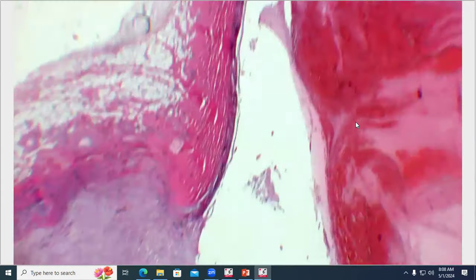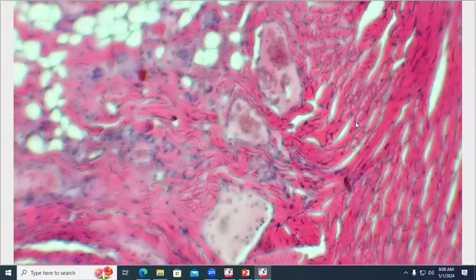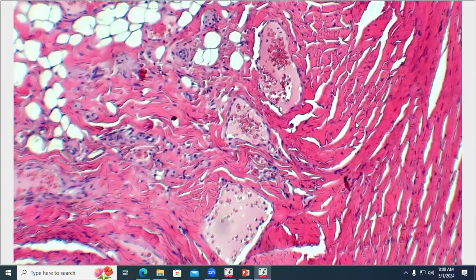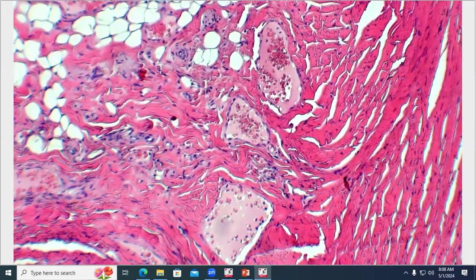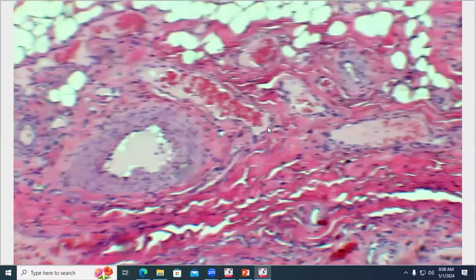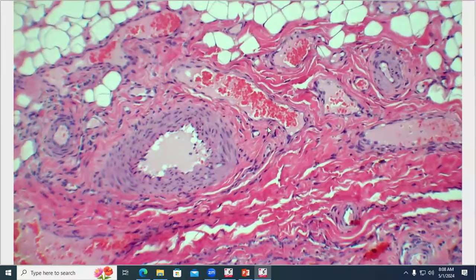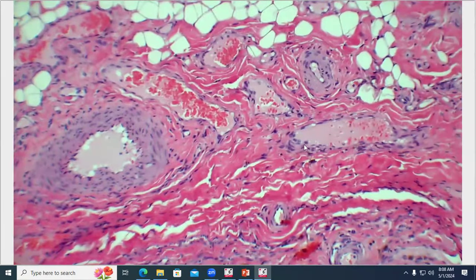In this case, if we do look at the vessels, there's something else that's interesting to see. So in particular, these vessels that are all around the optic nerve, the serum essentially behind these erythrocytes in vascular lumens is quite high protein, or very pink as well. Again, with the condenser in, there you go. See all of this pink serum. I'm gonna stop moving around and just let it sit here.